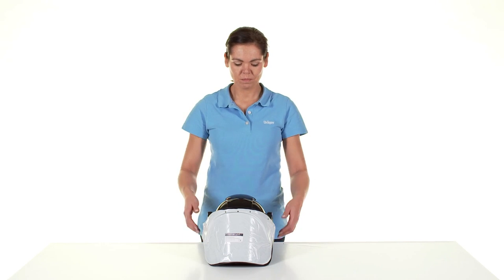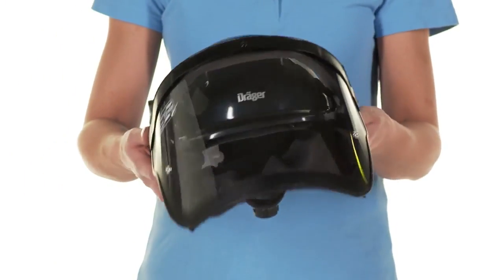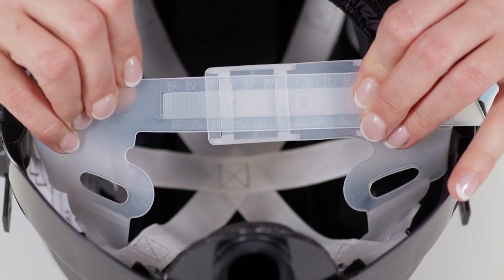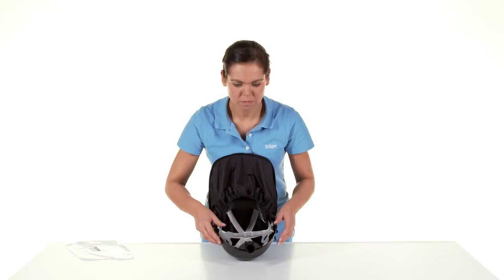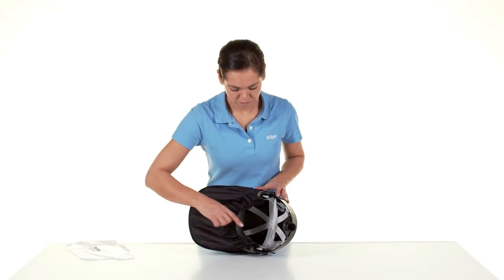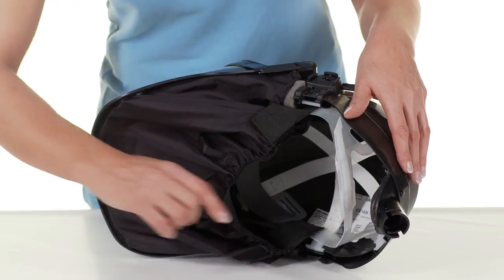Before first use, remove the protective film from the visor. Perform a visual inspection and function test before each use as well. Now adjust the support ring — it features a scale that indicates the head circumference in cm. To adjust, move the ends together until the support ring is set to your head size. The support ring should rest on the head above the ears. The four support ring flaps are equipped with three slots each. Attach the support ring to the buttons of the head harness so that the correct position is given.